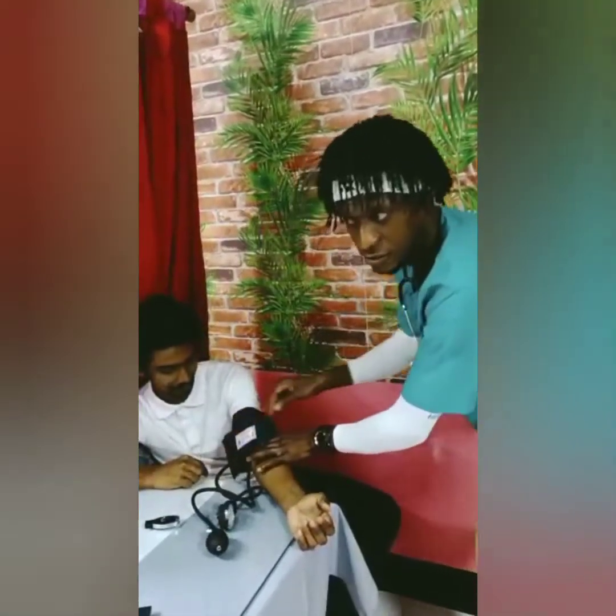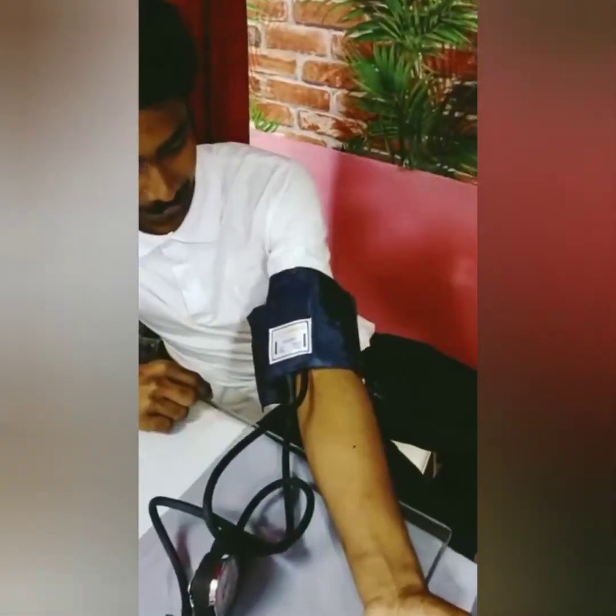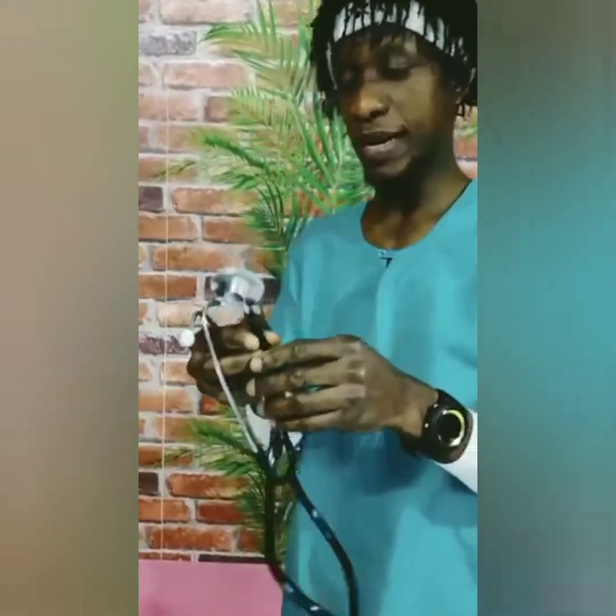First check the artery. And this is my stethoscope. With the stethoscope, you can use the diaphragm to listen, or you can use the bell to listen, but I prefer to use the diaphragm.